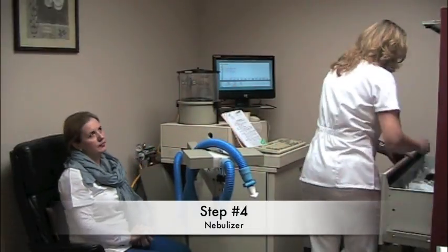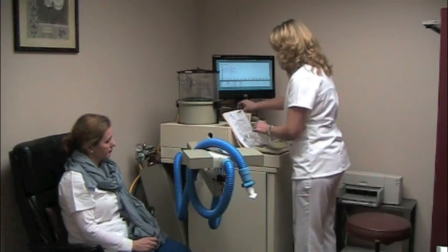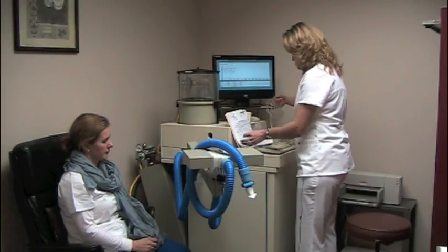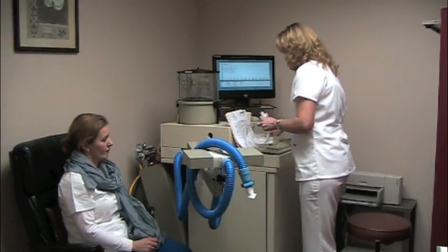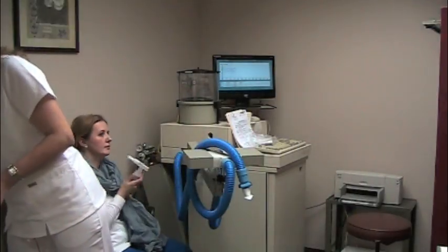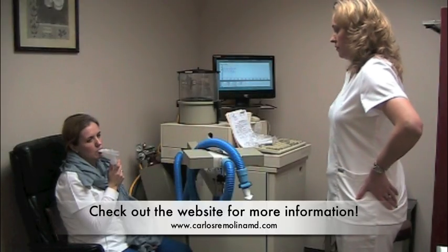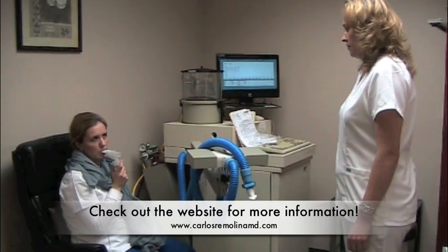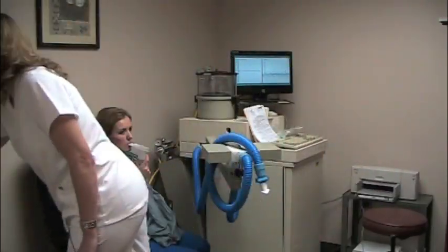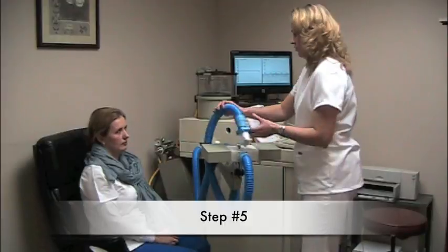Now I'm going to give you the nebulizer with medication, albuterol. And I want you to breathe normal. Now we're going to perform the post-drug test.